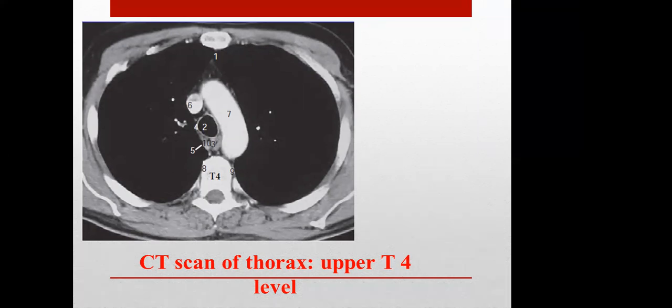Number one. Anterior junction line. Okay, this is the anterior junctional line.